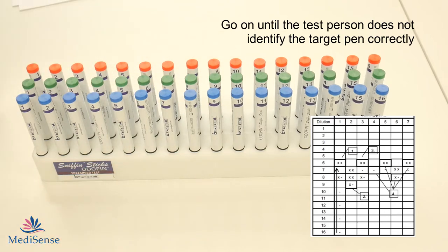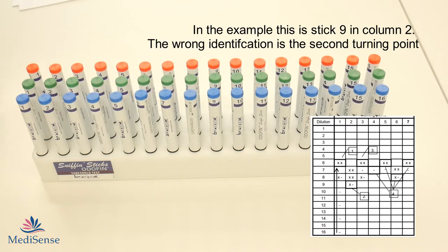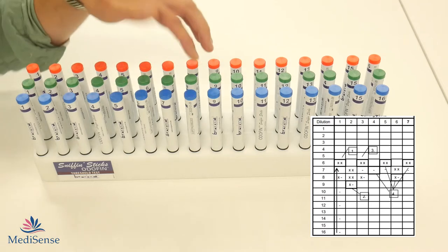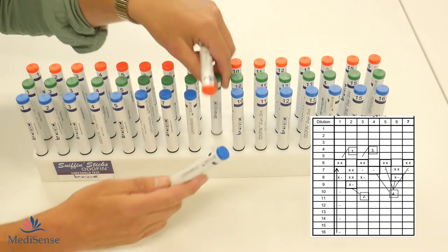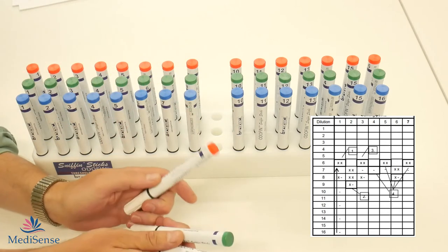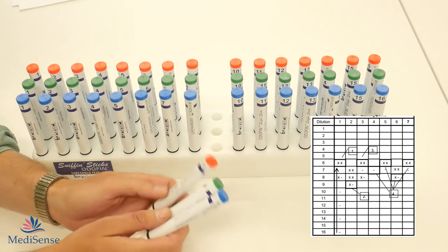You will continue until the test person does not identify the pen correctly. In the example you can see that was the pen sticks with number 9. The first time the pens were identified correctly and the second time they were not.